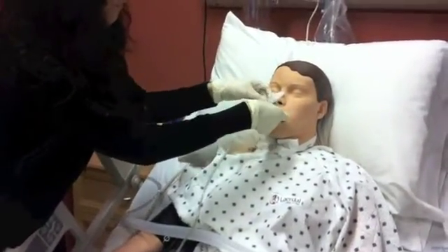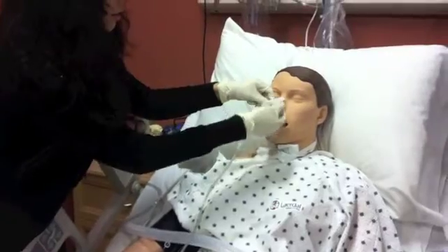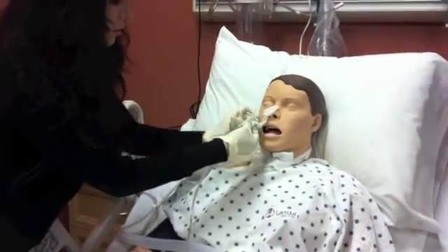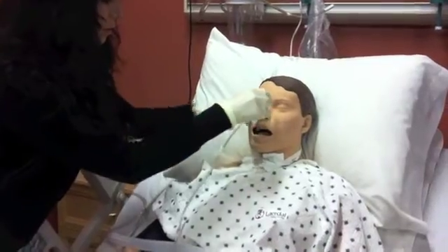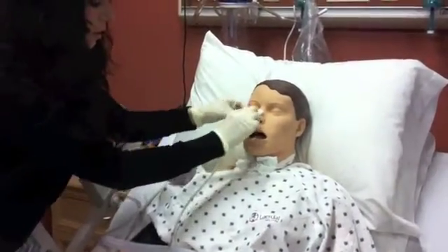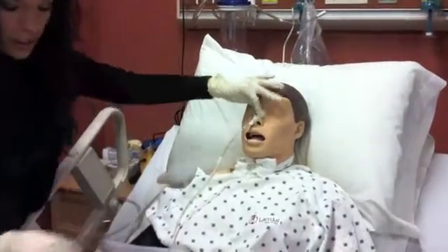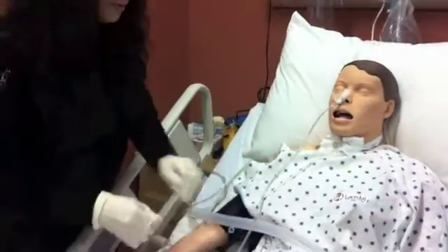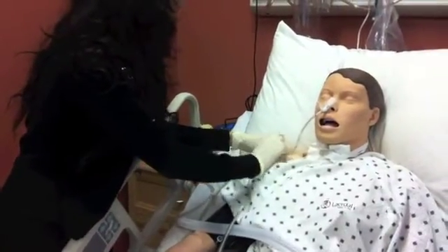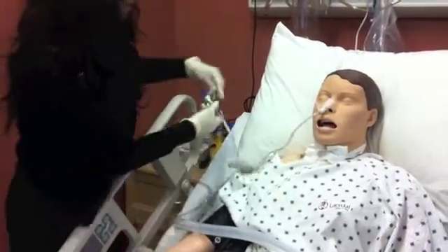When you've reached a place of resistance, tape the tube onto the patient's nose. Don't let go of the tube. Tape it into place, then tape or safety pin the tube onto the patient's gown.